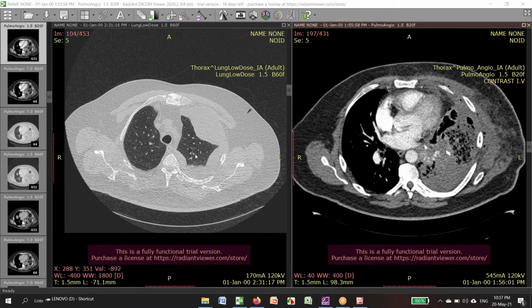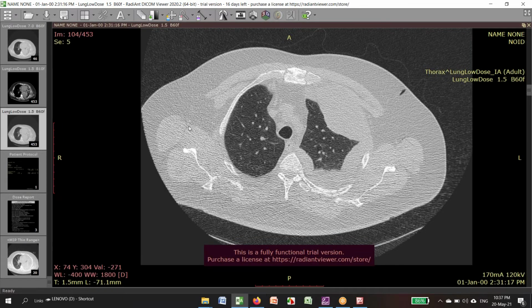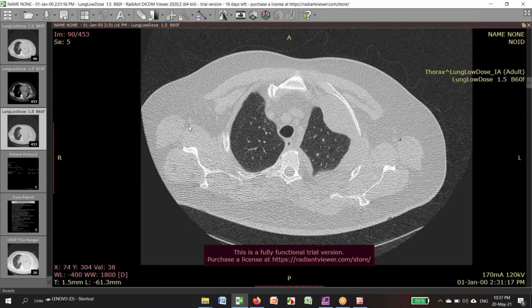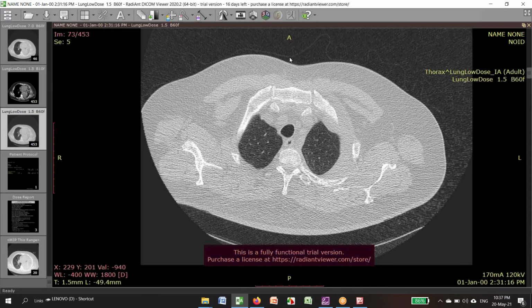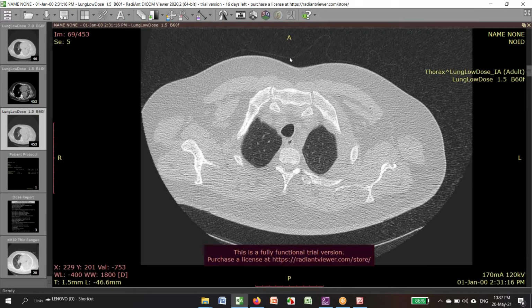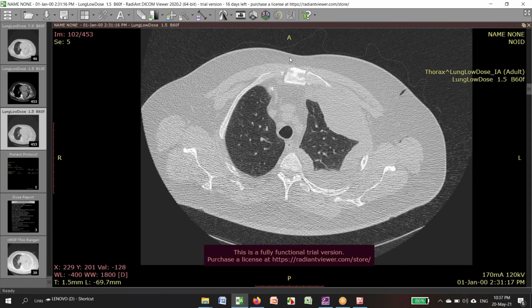So this was a case that I shared already with Professor Caney. I think it's very interesting, and it is actually a testament to the importance of thoracic imaging. So this is a man in his 50s, and about a week ago, he underwent a VATS resection of a nodule in his left lower lobe that proved to be a hamartoma. About 3 days after the operation, we were called for a consultation because he was feverish and felt fatigued, and he also reported a strange feeling in his left hemithorax, like it was bulging.